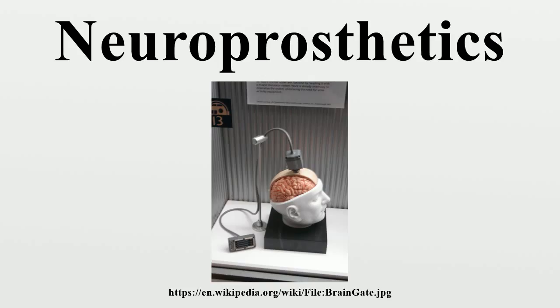Motor prosthetics. Devices which support the function of the autonomic nervous system include the implant for bladder control. In the somatic nervous system, attempts to aid conscious control of movement include functional electrical stimulation and the lumbar anterior root stimulator. Bladder control implants are used where a spinal cord lesion leads to paraplegia. Patients have difficulty emptying their bladders and this can cause infection.